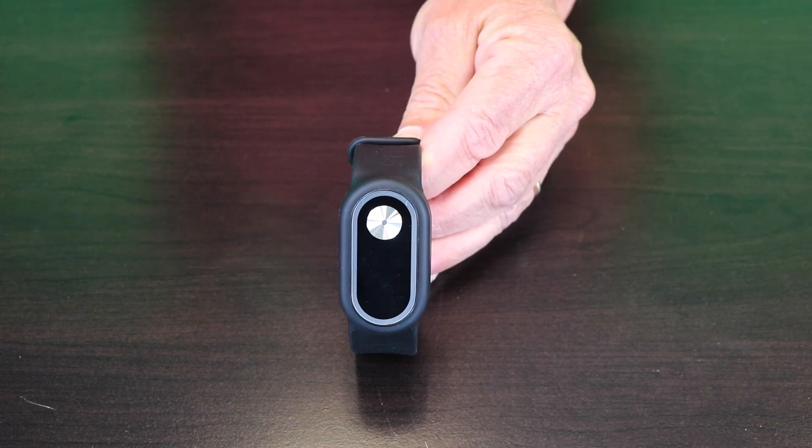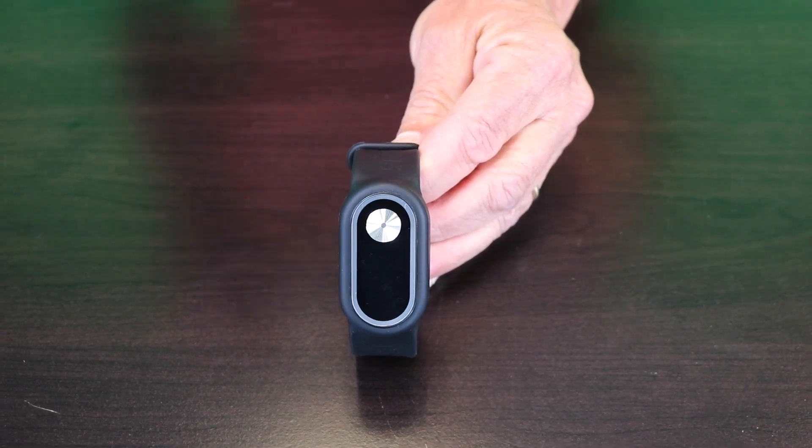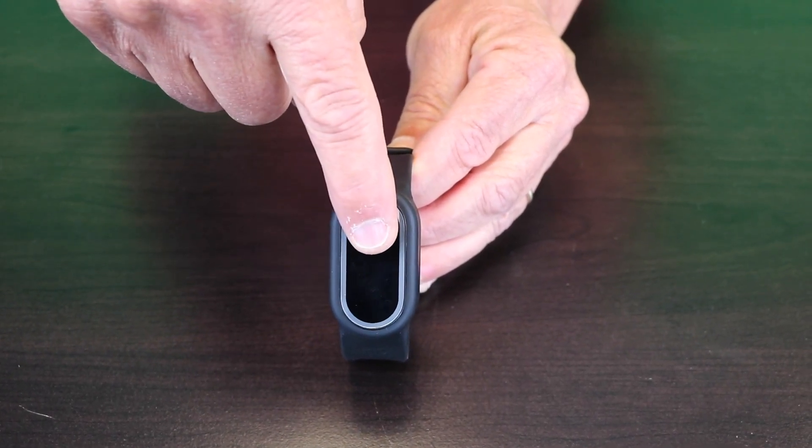When the blue light stops flashing, disconnect it from the charger, and a single one-second touch will activate the band. Once activated, you'll see the blue light will be on — it'll run for seven minutes, and then it'll go to red light, which is resting for 23 minutes.